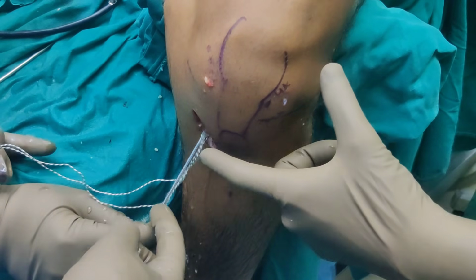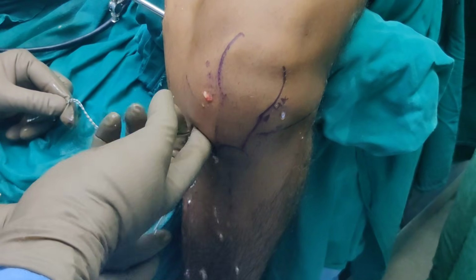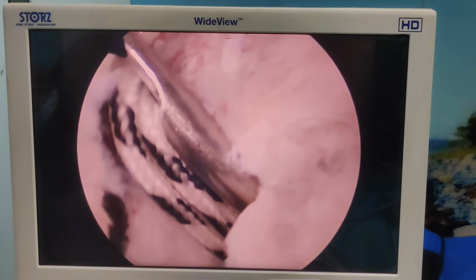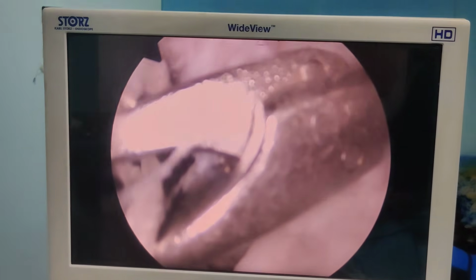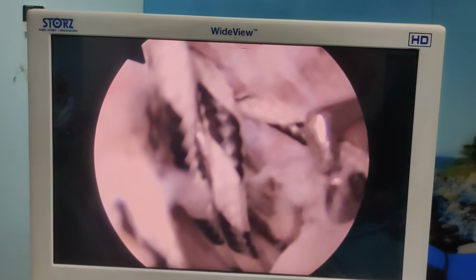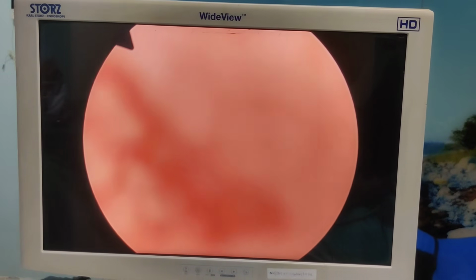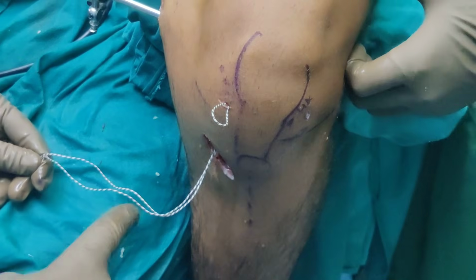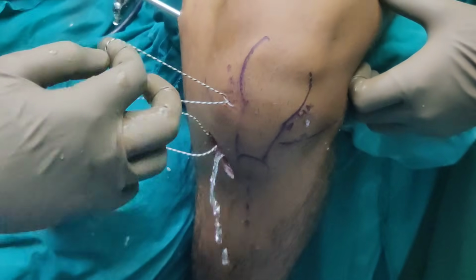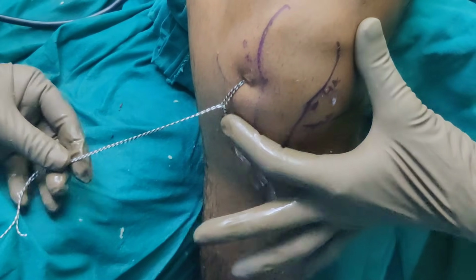Now we have taken a suture passer, so we are going to take the suture out in the back of the knee. So this is our suture out from the back of the knee. Now my suture retriever has gone from the anterior medial portal, and I have caught this, and I am trying to bring it out from the anterior medial portal. So we have gone from here, gone on the back, and from here I have retrieved it out. Now this can be quite a tricky job, but on this occasion we were lucky. We're running out of luck because of a lot of equipment issues today, but on this occasion it was very smooth.